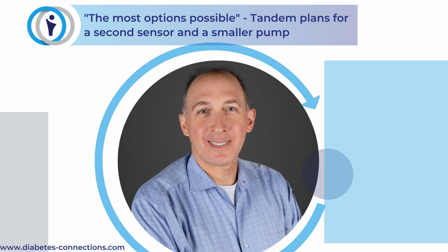to use. So you don't have to remember, did I set exercise activity an hour ahead of time, right? Because a lot of the times, and your listeners will know, if you change these settings at mealtime and your blood sugar is already dropping, it is very difficult to prevent, for example, low blood sugar. There's still work to do to make these more automated, if you will, around these challenging activities.